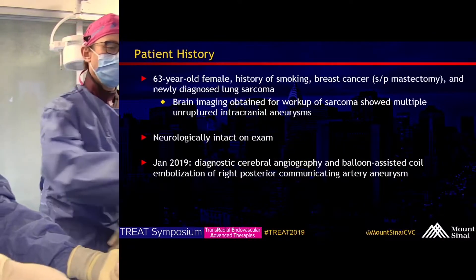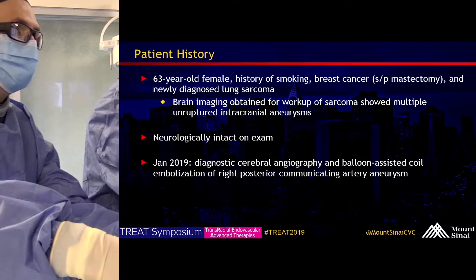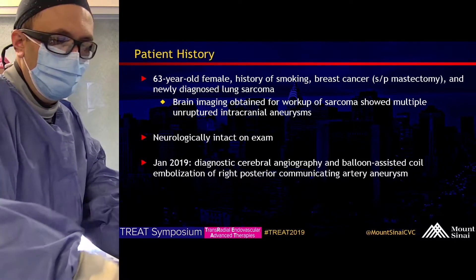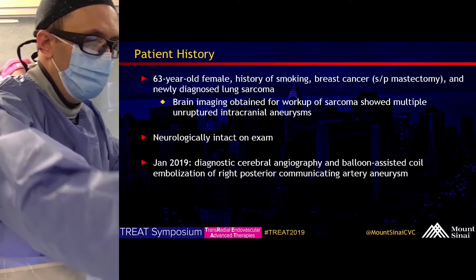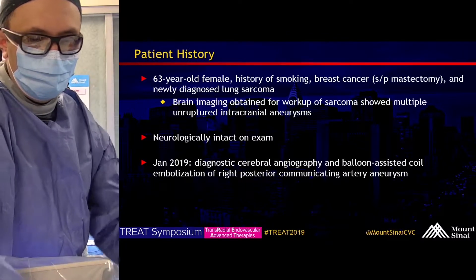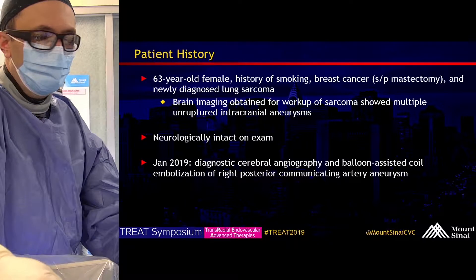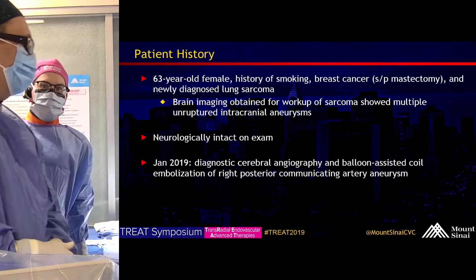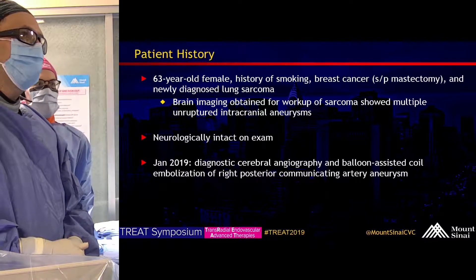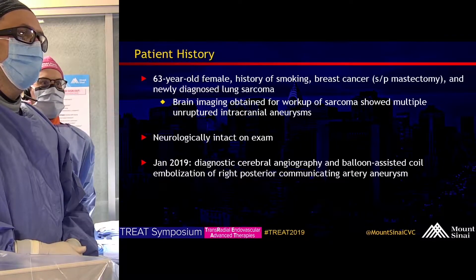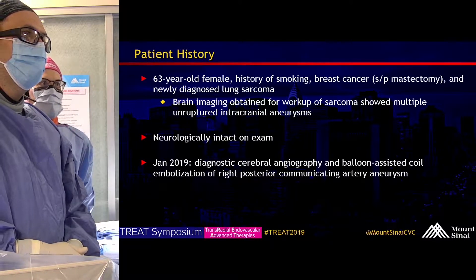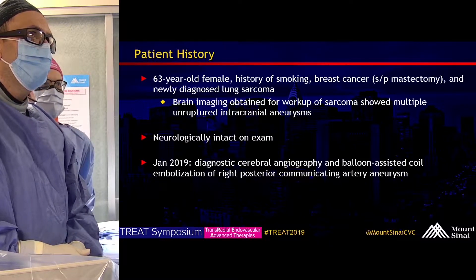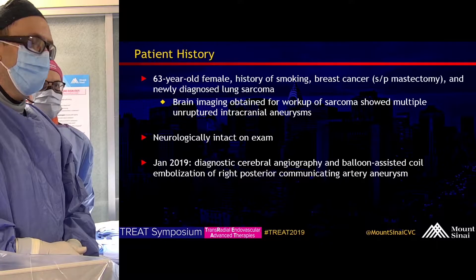There's a 63-year-old female with a history of smoking, breast cancer, and lung sarcoma. Based on the lung cancer workup, she got brain imaging — CT head with contrast — which showed multiple intracranial aneurysms. She was recently treated for one of these aneurysms, a right PCOM aneurysm — that's the coil mass we're looking at right now. We're bringing her back electively for two unruptured MCA aneurysms.